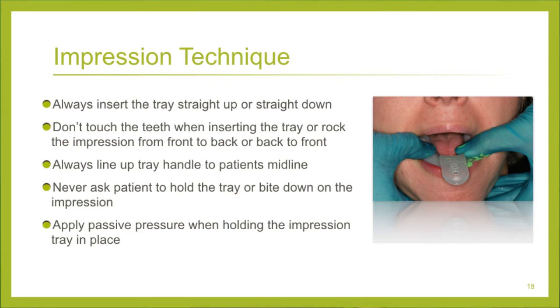Same for the lower. Getting it in, always insert the tray straight up or straight down, and I can't say that enough. Don't touch the teeth. Never ask the patient to hold this tray. There have been times where I've seen assistants tell the patient to take their hands and hold the tray in place. Patients don't know how much pressure they need to put on that tray, and you don't want to leave it up to them to make sure that it's seated all the way.